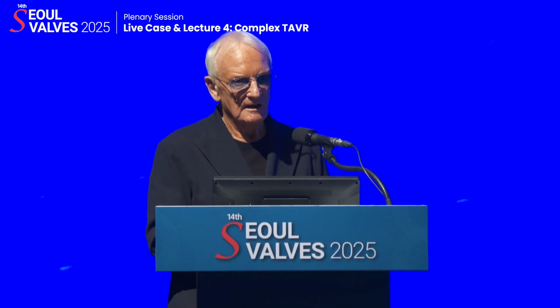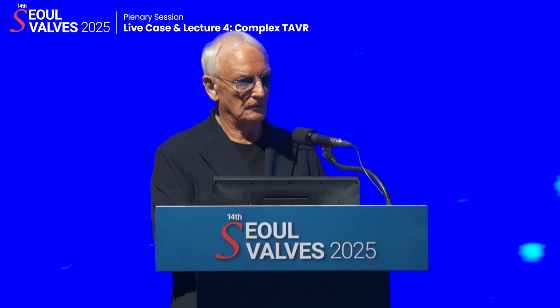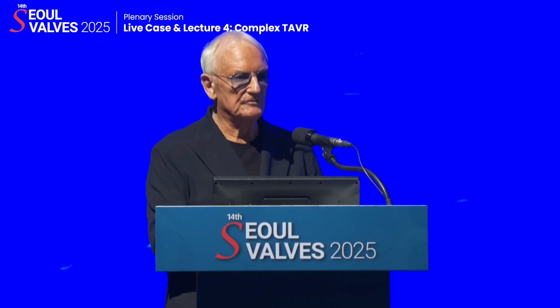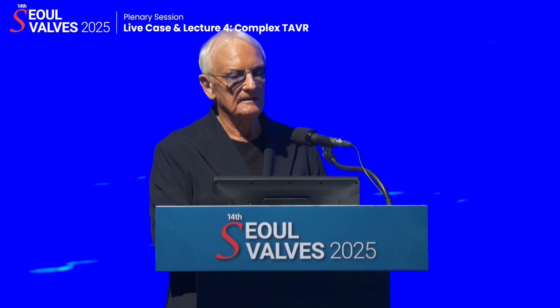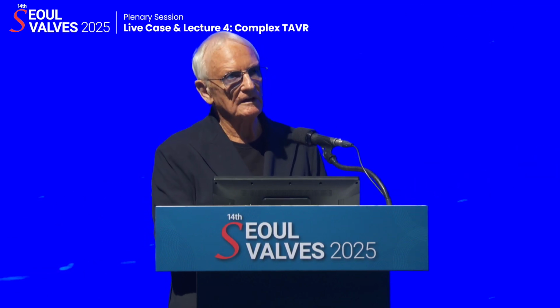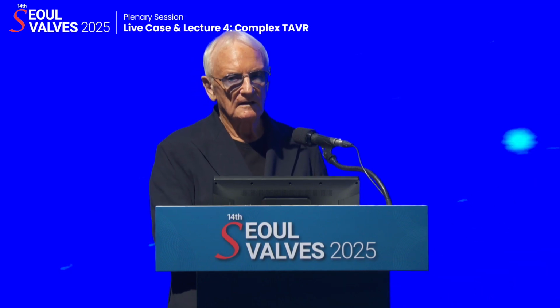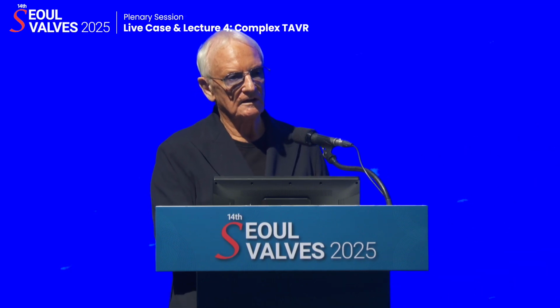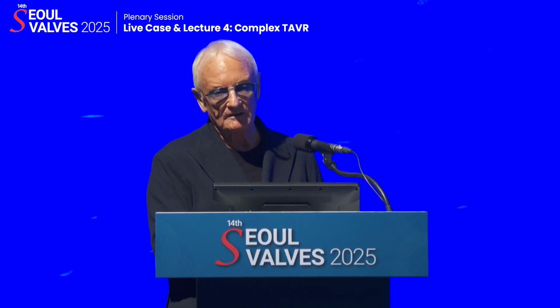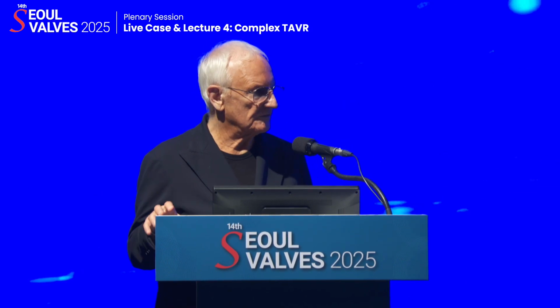So it's a very small group of patients, and that's why the enrollment is so slow and the numbers are so low. However, dollars will be spent on valves because first generation, as we all know, is not so good. My prediction is that we move forward, but we have to get other solutions in order to address this, particularly intermediate and lower risk patients. And I will talk about this this afternoon.